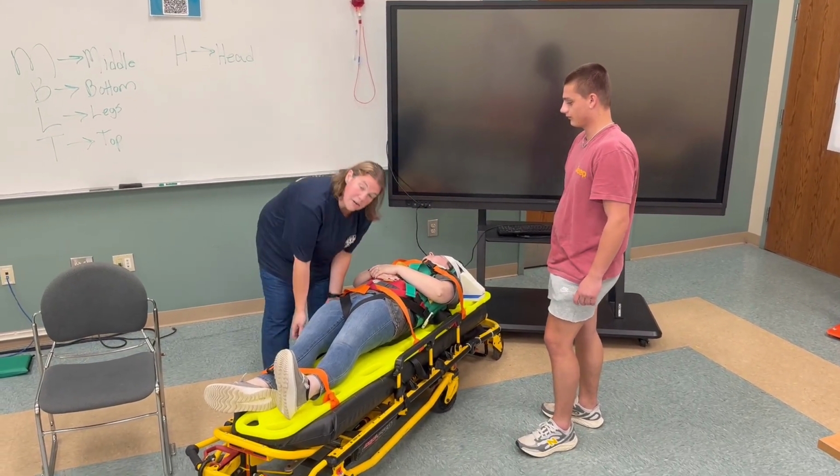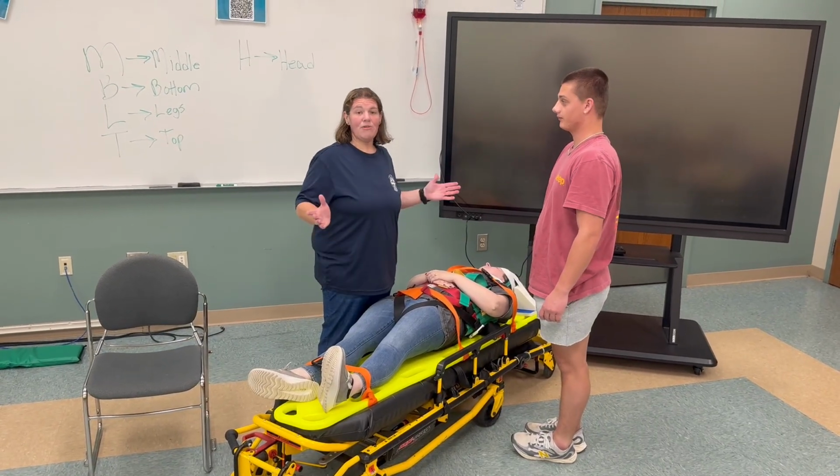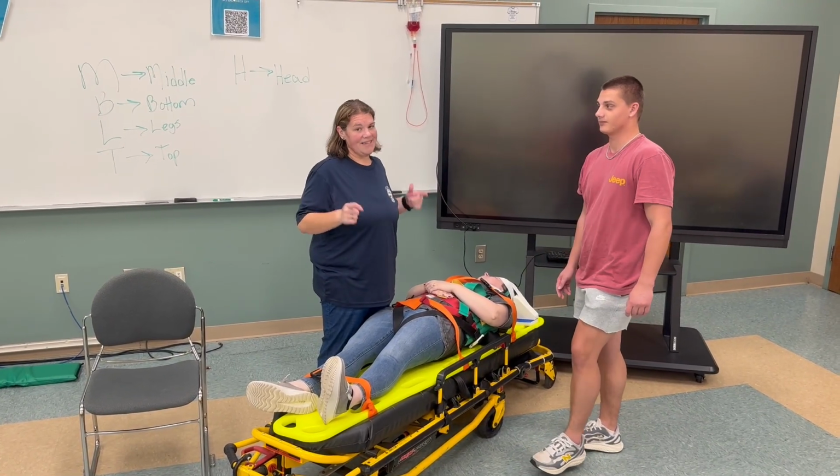Now this patient is ready to be transported to the hospital safely. If you have any questions, feel free to let me know. This is the KED. Bye.